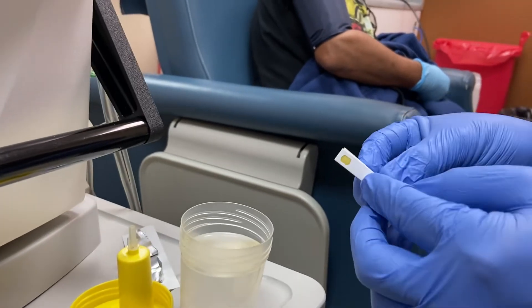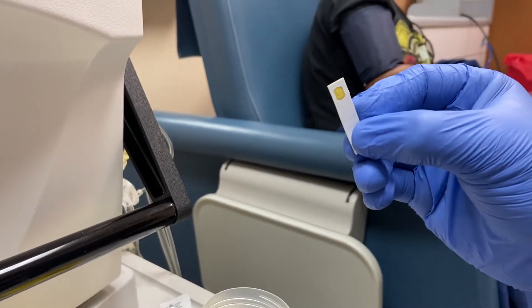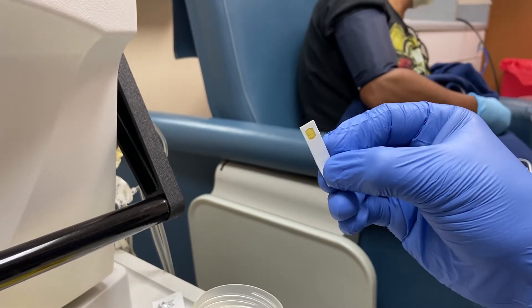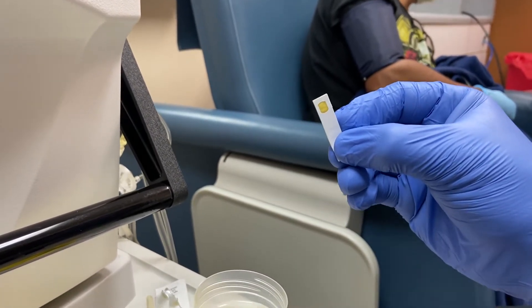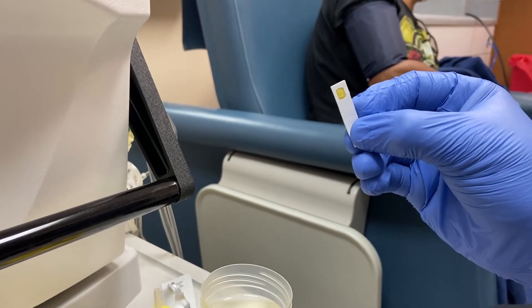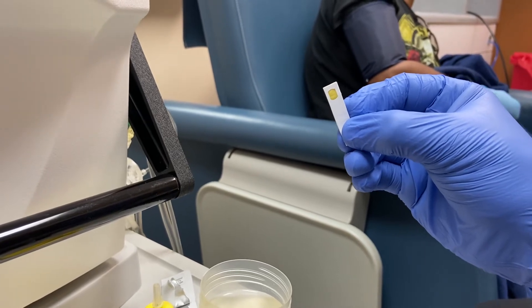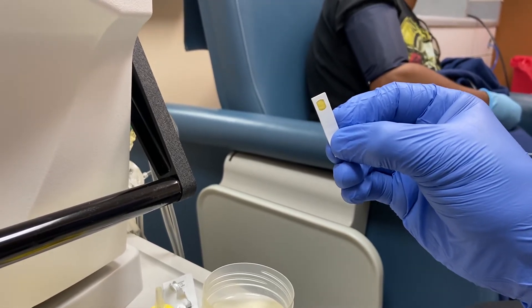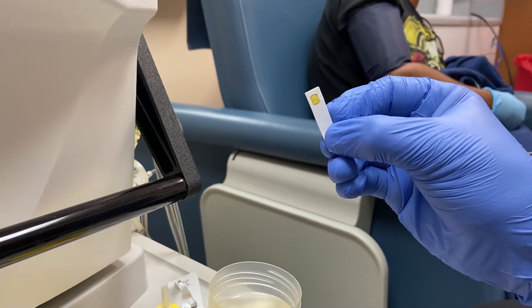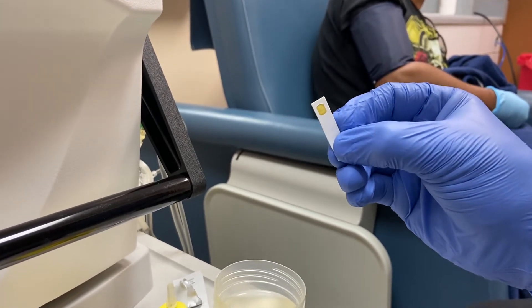Show it to the video. And you count 20 seconds — it's 1, 2, 3, 4, 5, 6, 7, 8, 9, 10, 11, 12, 13, 14, 15, 16, 17, 18, 19, 20.